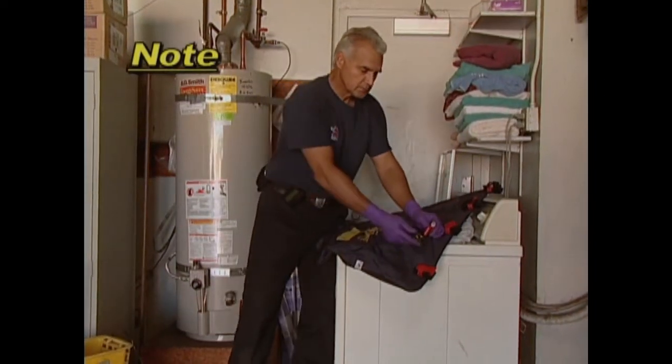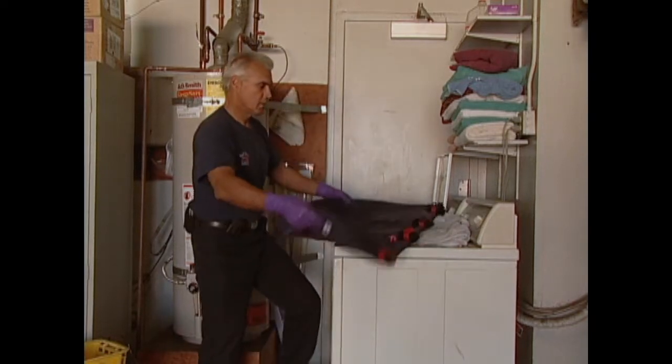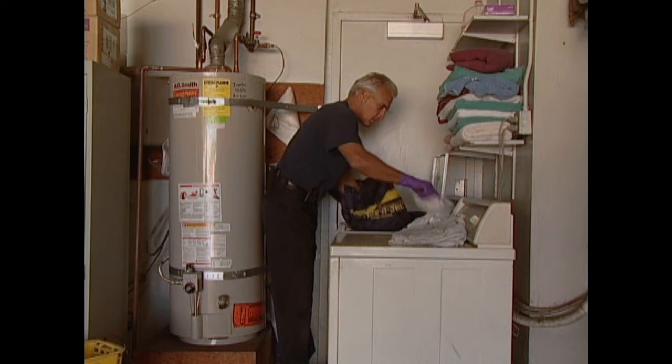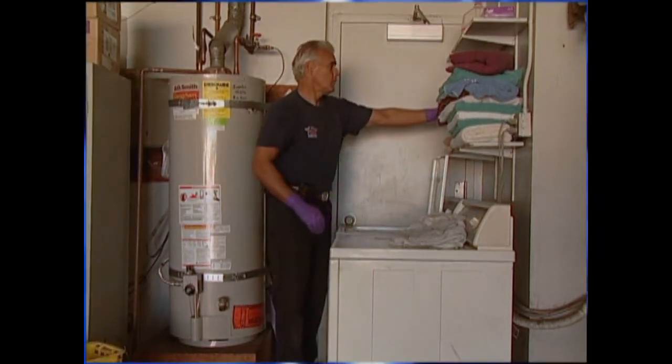Note: the EVAC-U-SPLINT can be machine washed using a washing machine without an agitator. Please make sure the maxi valve is protected with the red leash cap prior to placing the splint into the washing machine.